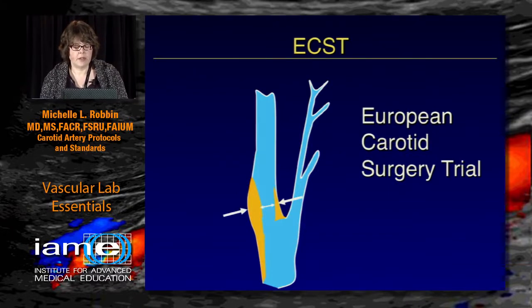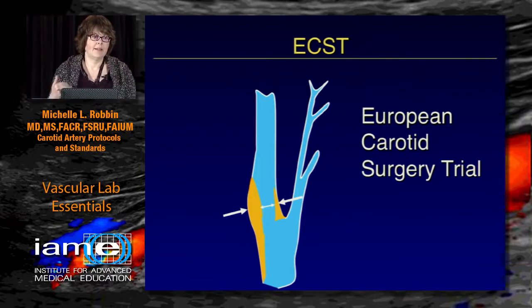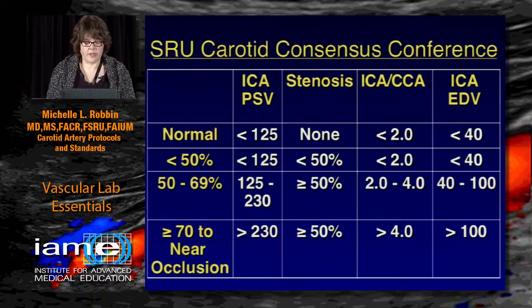And the European Carotid Surgery Trial looked at the overall bulb. So again, when you're reading the literature critically, you have to ask, what are their standards? How are they measuring it? And look into it very, very carefully.